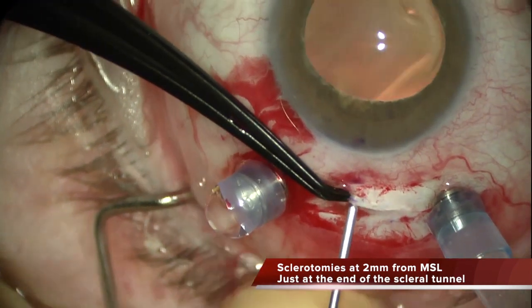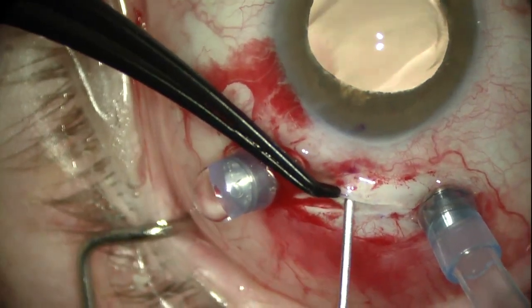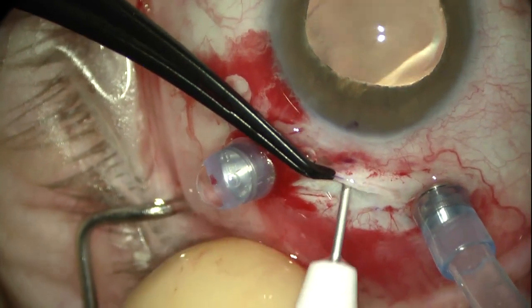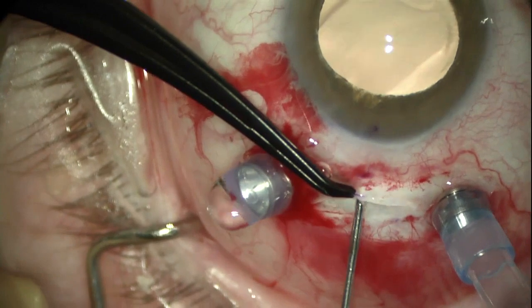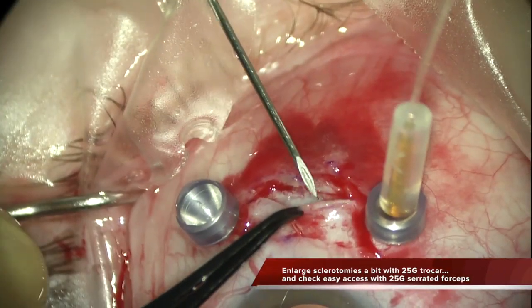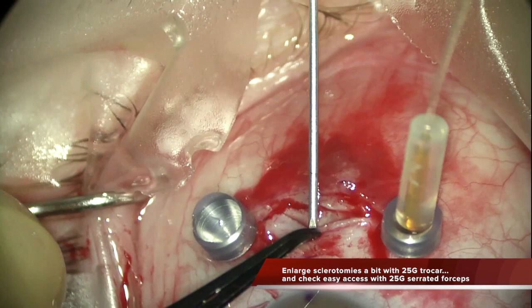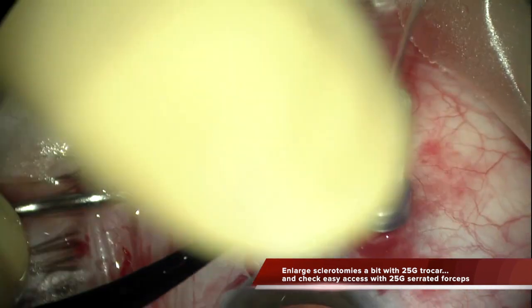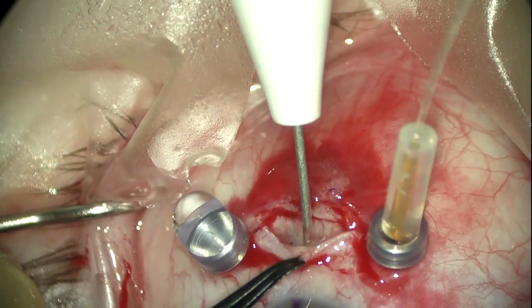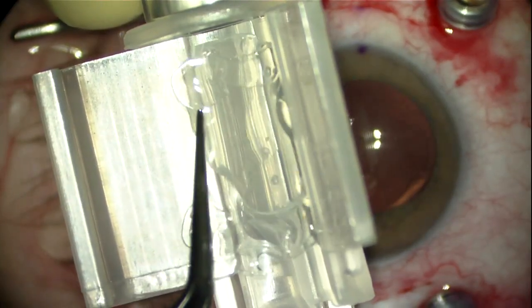Then you enter the vitreous cavity at the sulcus with an incision parallel to the iris plane. It is important to enlarge the incision with the 25G trocar to be able to enter the eye easily with no resistance, using the 25G serrated forceps in order to avoid any problems during IOL plug extrusion. The same is done on the other side — slide the needle until you reach the end of the tunnel, 2mm from the limbus. Then the access into the sulcus is completed, enlarged, and checked with the serrated 25G IOL forceps.